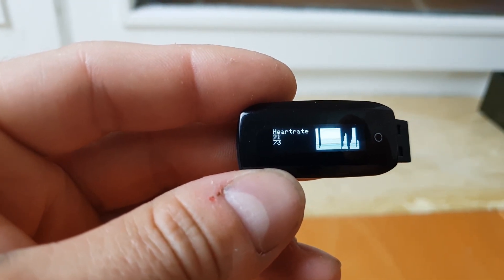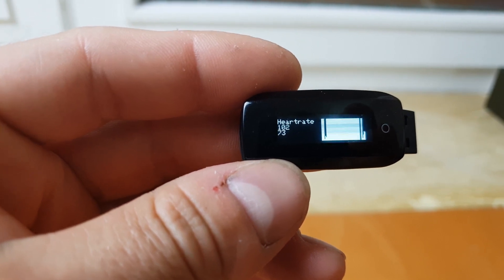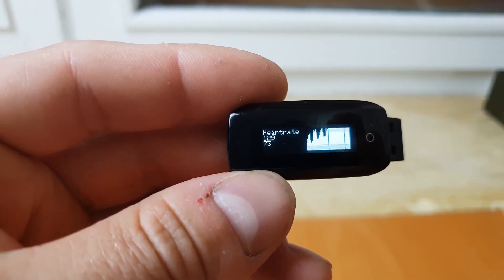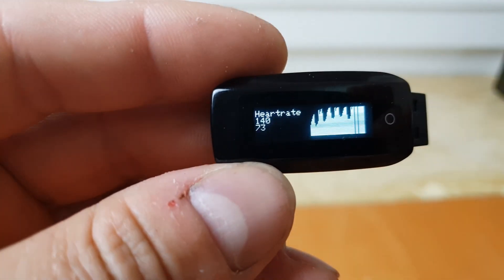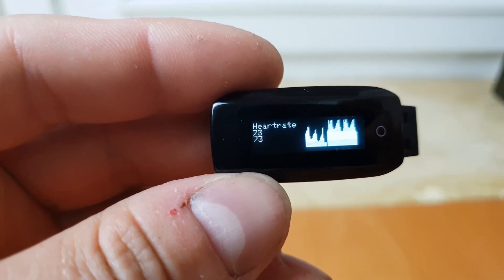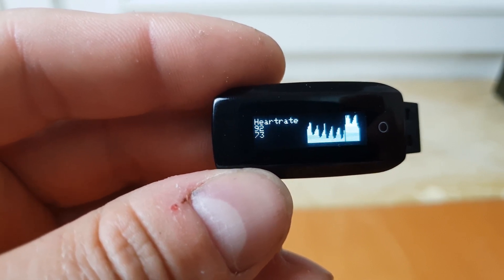I'll try to be a little bit silent. The top value is a raw value we're getting from the sensor, and the bottom value is the heart rate calculated from those values.